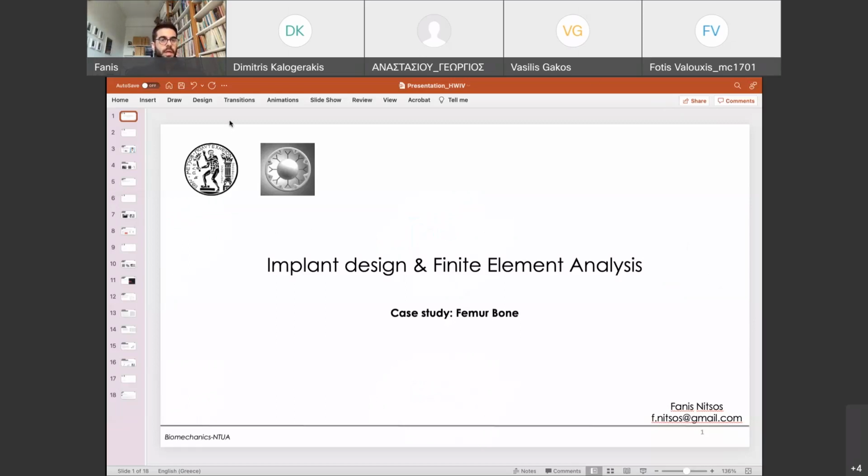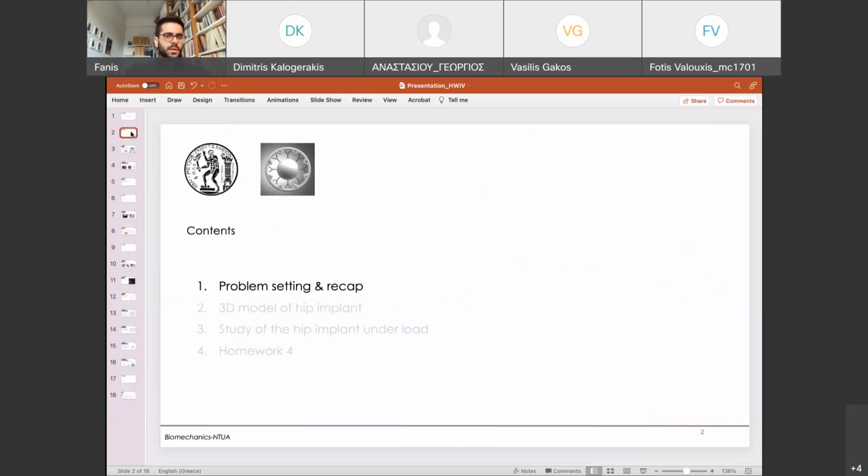Okay, thanks guys. So today we're going to see how we can design a femur implant and perform a finite element analysis on it for some loading scenarios. So we will repeat what our problem is, and we will do a very brief recap of what we did in the first workshop, as this is a continuation essentially.